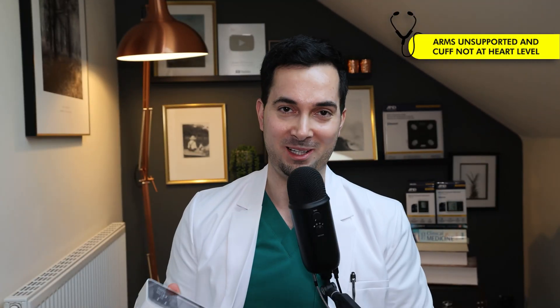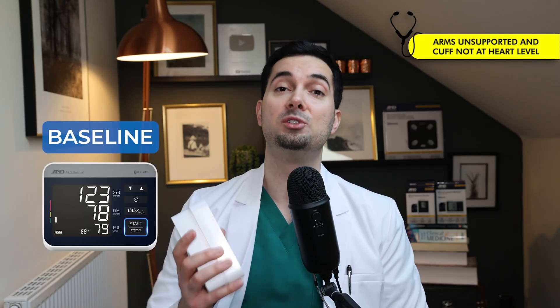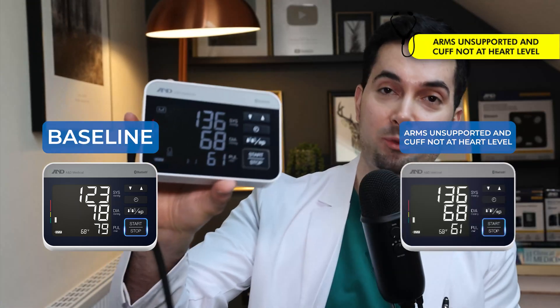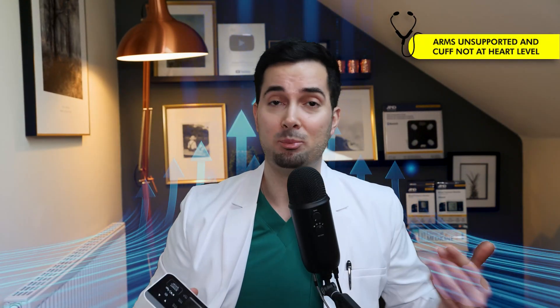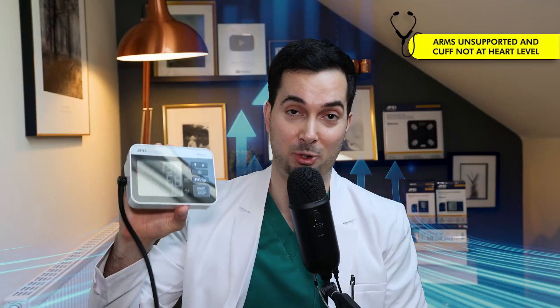Results are in — I really enjoyed doing this experiment. Remember, our baseline was 123/78 mmHg. With the arm unsupported and cuff not at heart level, my reading was 136 over 68 — 136/68. You can see there's been a massive increase in the systolic. It's really important that we're in the right position, feeling supported when doing the blood pressure, so we don't artificially bring up our reading.